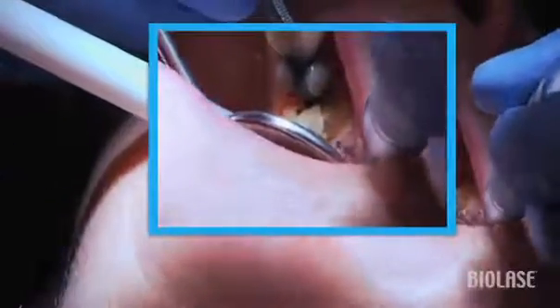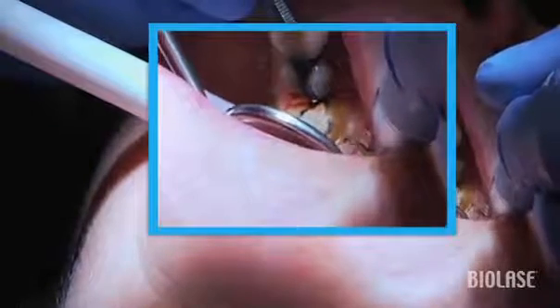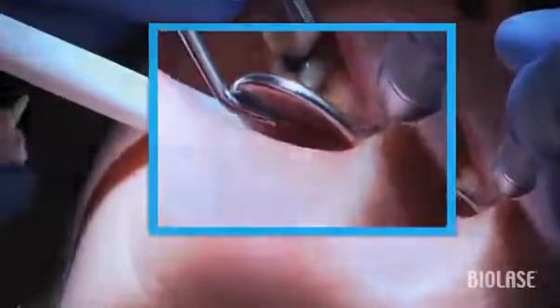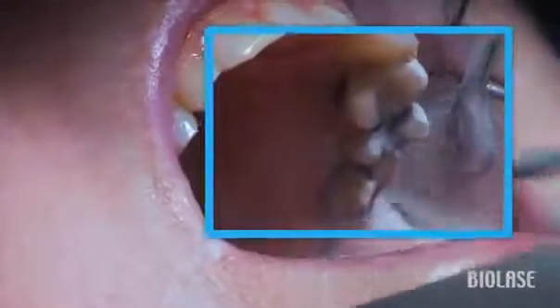Sometimes you might not need to do a bony crown lengthening, and instead would need to both thin and decrease the height of the tissue in relation to your margin. In that case, you would direct the laser energy both parallel and perpendicular to the tooth. If you have troughed the tissue well, you will see some clear separation or space between the margin of your crown prep and the adjacent gum tissue.